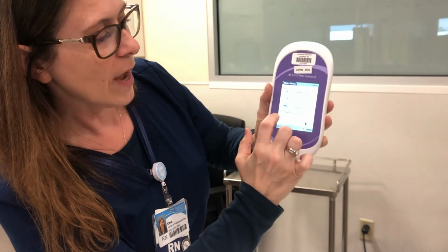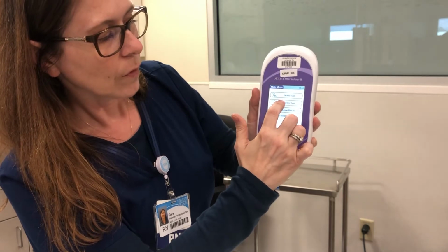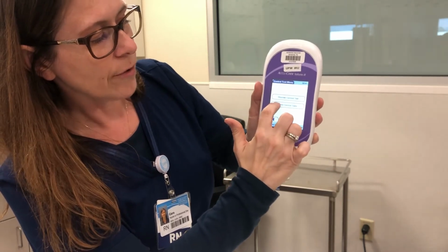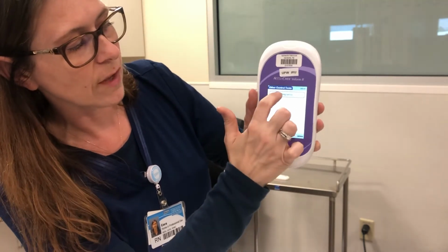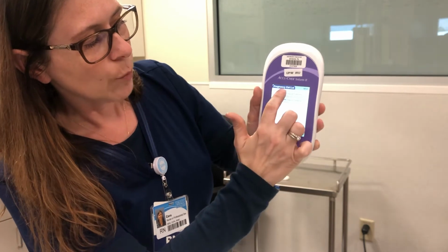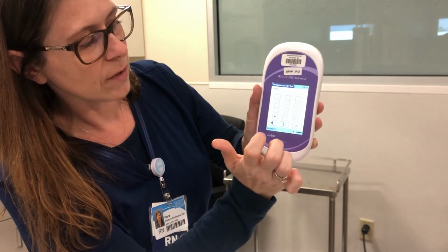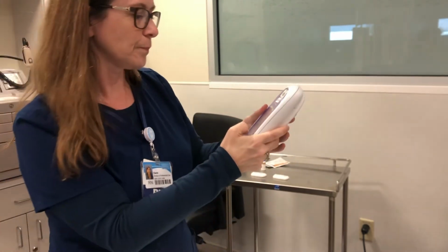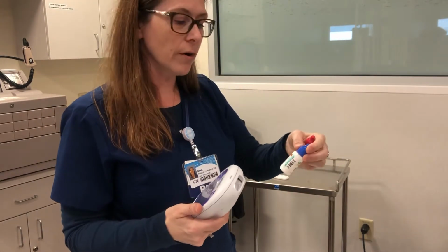And actually, if I go back, when you're ready to put in a patient, let's just start with that. So control test. You're going to add other control tests, so not the glucose control, other control tests, and it's a pregnancy. And we are doing our positive liquid control. So let's run positives first. So it's asking you for the pregnancy control lot. And it's already in there. Like I said, these are older lots, but they are starting a new one.